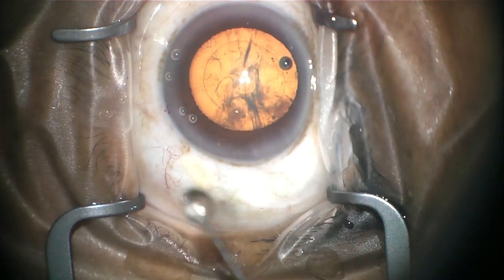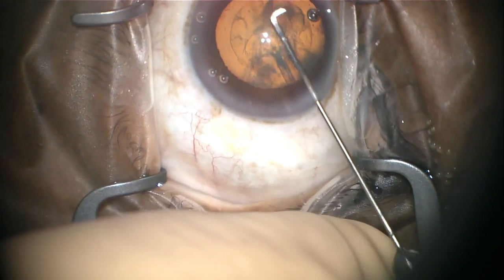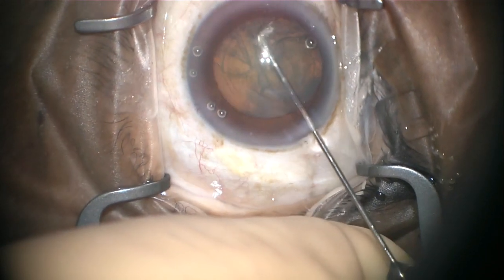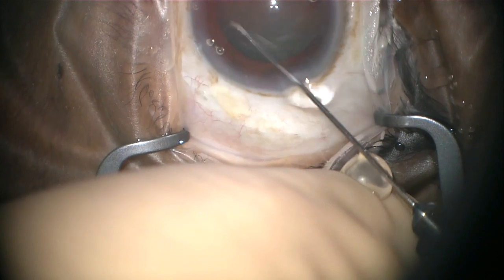A special fluid is then used to gently dissect your lens away from that capsular bag. This is called hydrodissection, which makes your cataract much easier to remove.